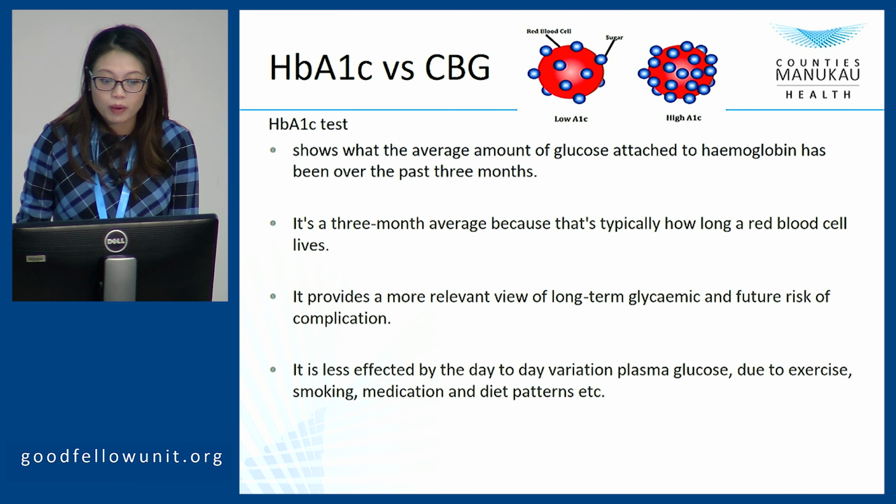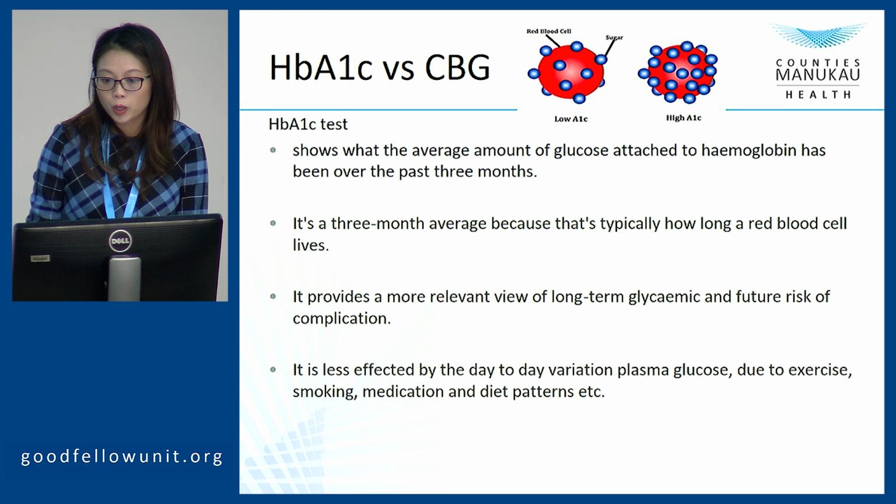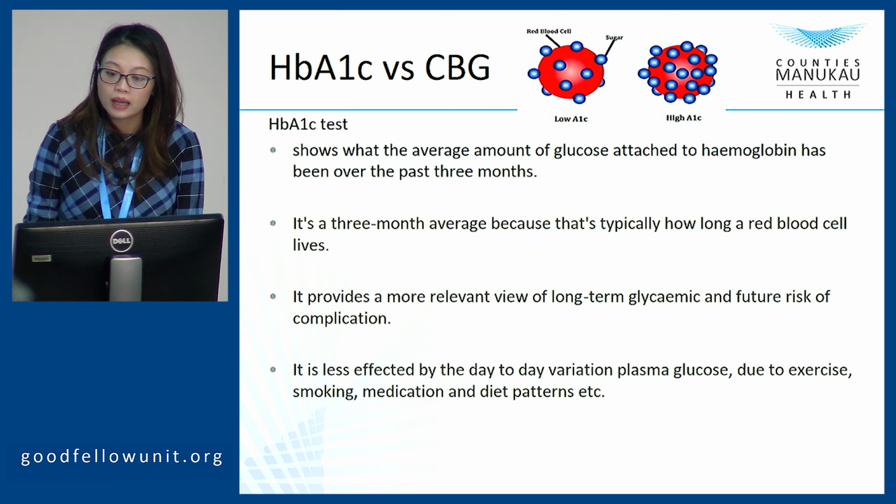So blood glucose monitoring is a cornerstone of diabetes care. Our aim is to keep the blood glucose level as near to normal as possible because it allows us to identify the patterns of high or low blood glucose level, and it's a guide to suggest if the diabetes is under control or helps us to adjust the therapy as needed, and also helps us to balance the food, exercise, and insulin dose. So being aware of the blood glucose level is very important.